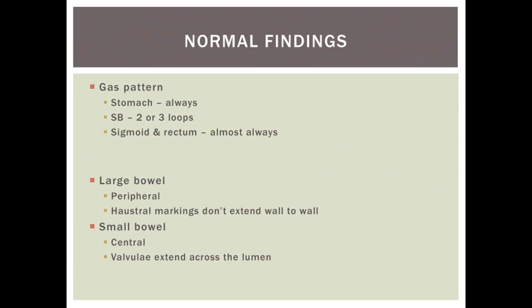The bowel gas pattern seen should give you a lot of information, and remember that gas appears black on x-rays. You should always expect to see some air in the stomach, in two or three loops of small bowel, and almost always in the sigmoid colon and rectum. Seeing more gas than this may suggest the presence of bowel obstruction.